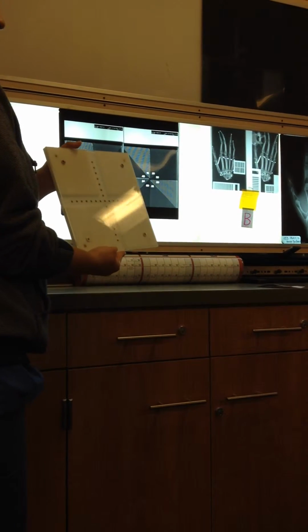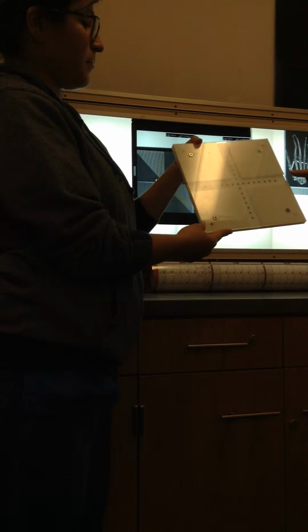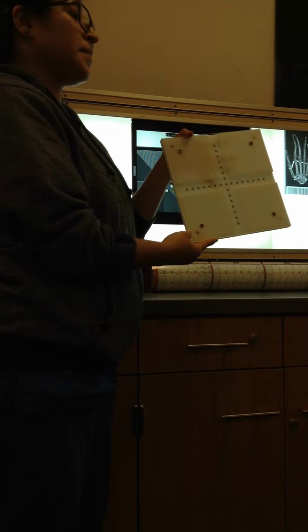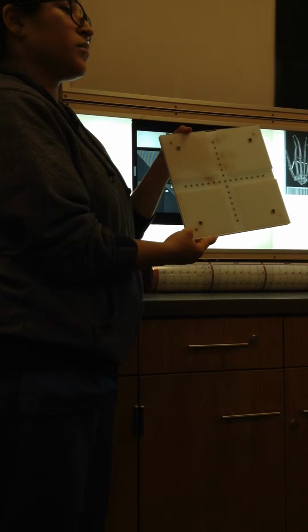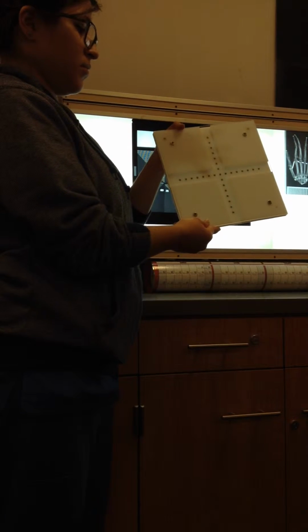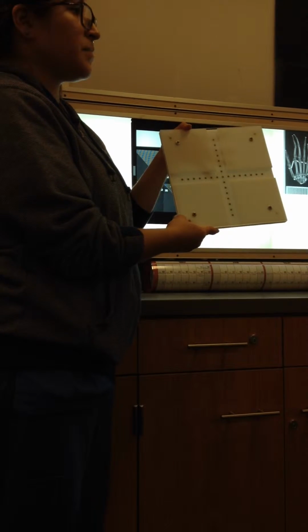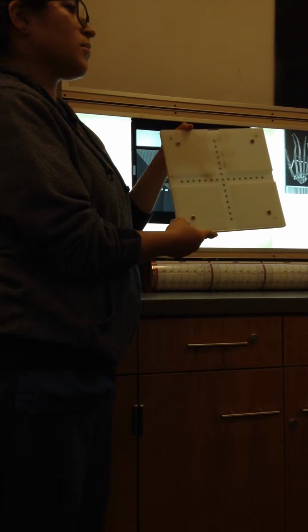Okay, what else you got? I don't know. Okay, what does this look like that we just went over? It has little bars that go in and out here. What is that measured regarding fluoroscopy? Is that the pink cushion thing? Yeah, the fluoro shutters. So they have little bars that you can set the size of the fluoroscopy shutter and then make an image and make sure it's within the size you put there. So both of these are fluoroscopy test tools. That one measures shutters. This one just measures resolution.